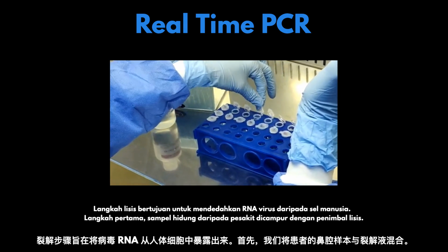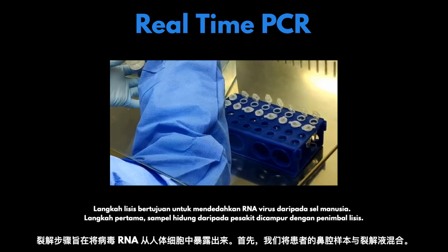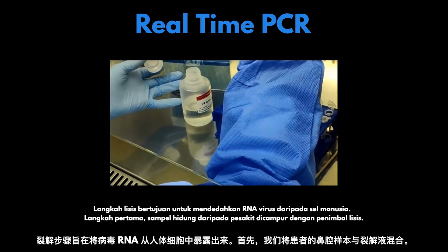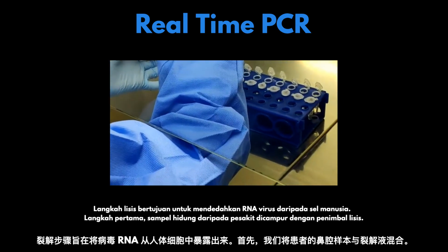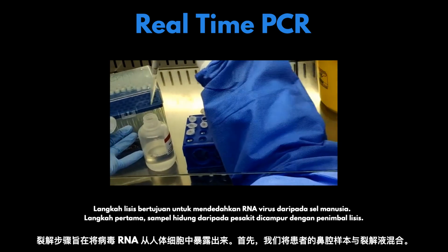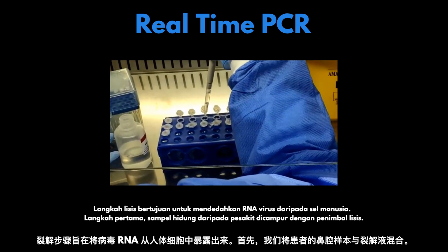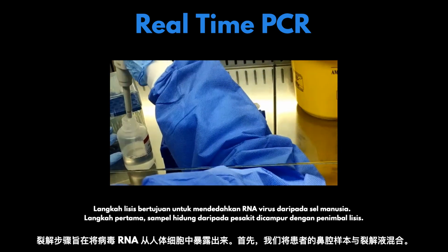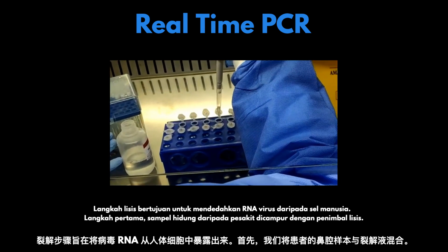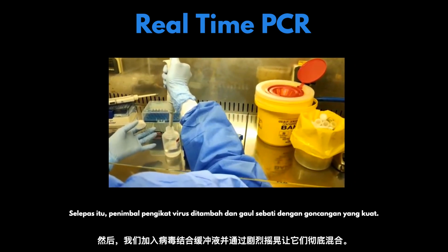First, the nasal sample from patient is mixed with lysis buffer. Subsequently, virus binding buffer is added and mixed thoroughly by vigorous shaking.